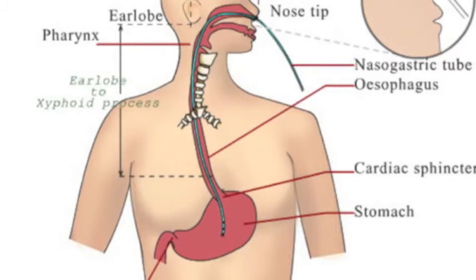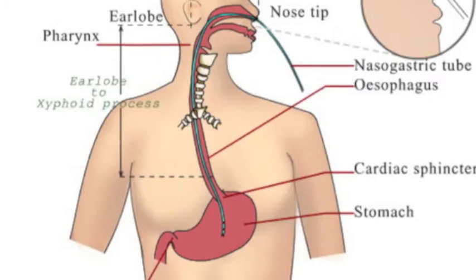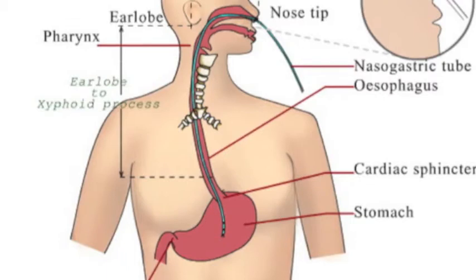If you're going to have tubing from your suction canister, this is going to have a little male-female lock that goes right here. If you don't have something right here, that stuff is going to come out. So you have a little pigtail thing that goes in here. This goes in here, and then your suction canister tubing goes here.